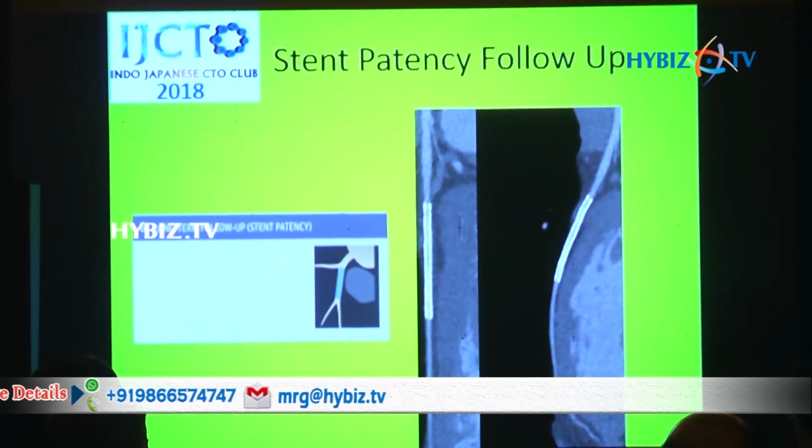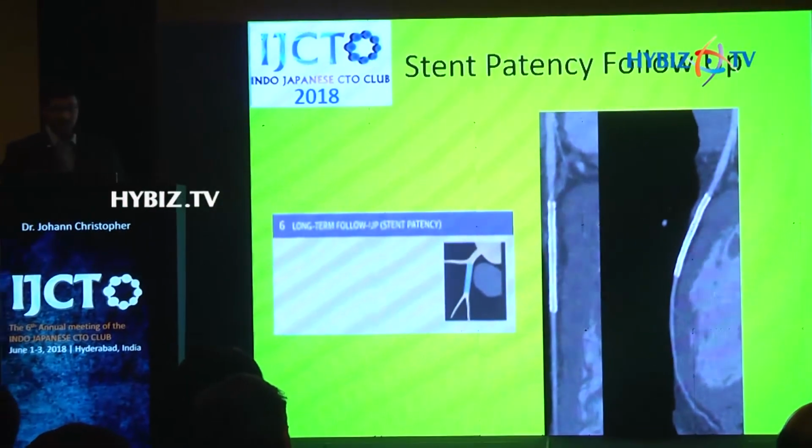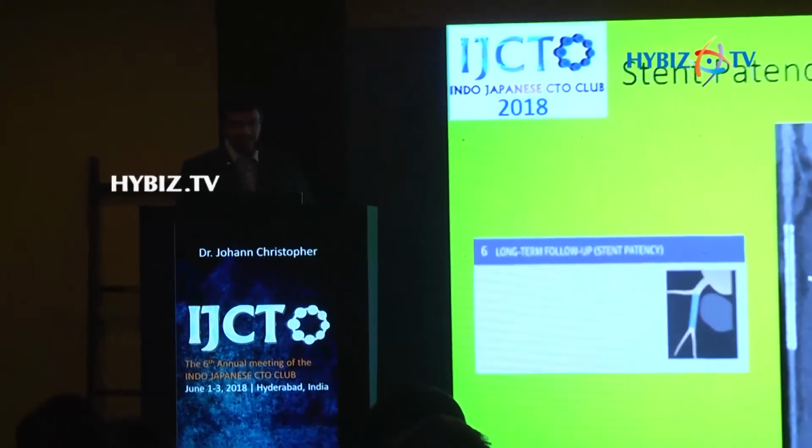And finally, when these patients come back, CT is a great tool to follow them up at 6 months, 12 months. We have some 12-month data of some of our CTOs, which we do CTA. It's a non-invasive 5-second scan, and you can see very pristine images of the stents, and if there's any in-stent restenosis. Just a little word about stent follow-up: we are looking at something like 90 to 92% if you're using a 128-slice scanner or above.